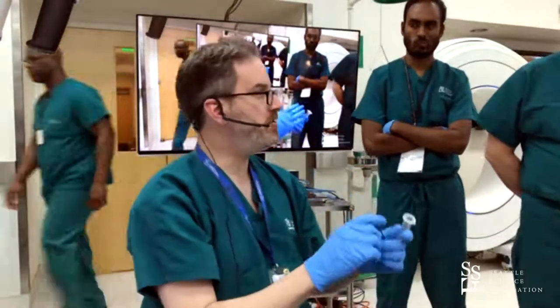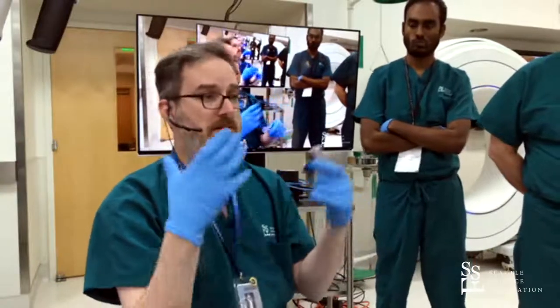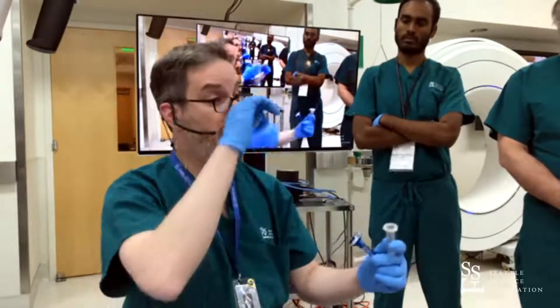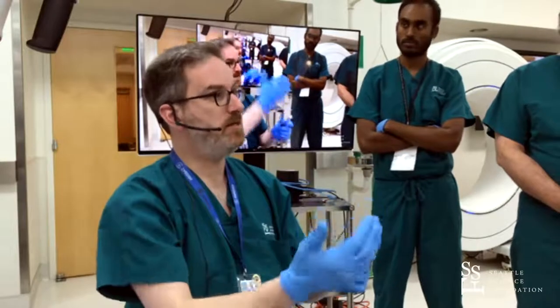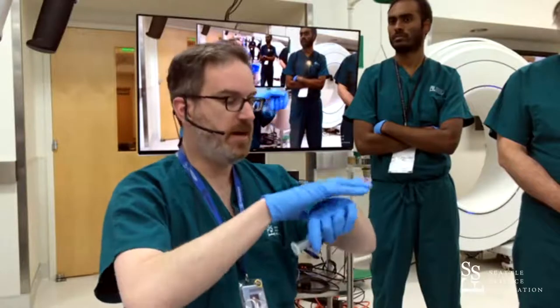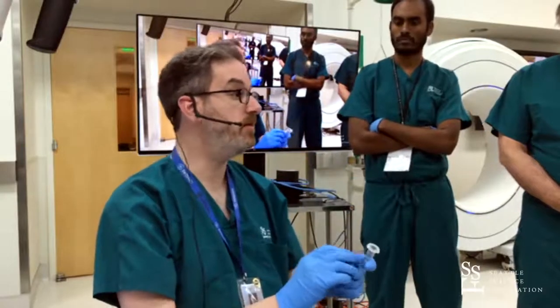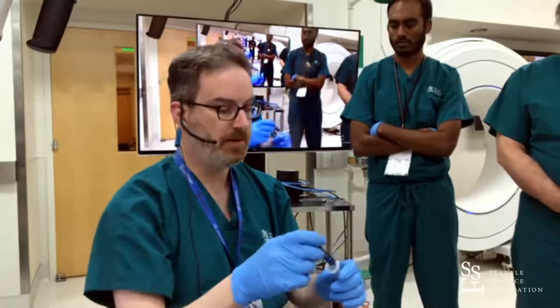You pull the port out and you'll be working through a small cortical cuff of white matter. That's probably a really good way to start if you're going for an intraparenchymal lesion, because it's similar to what you would experience with a microscope — you're dissecting through normal tissue and then you get to abnormal. It makes it much easier to recognize that transition, maintain situational awareness, and perform an extracapsular dissection, as was mentioned earlier, especially if you're talking about a glioma and trying to stay on the outside of it.